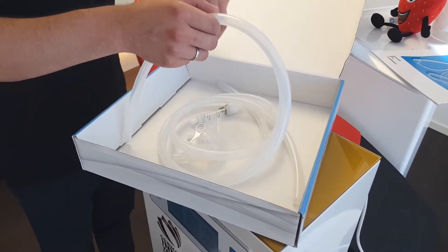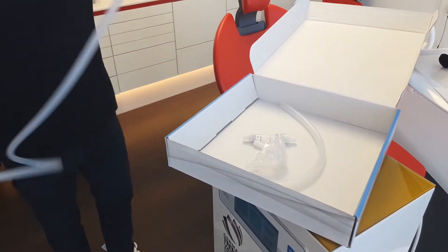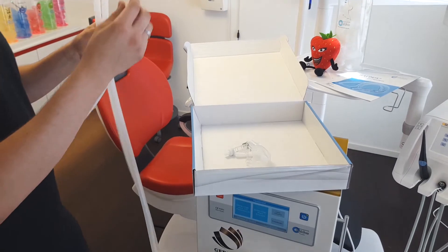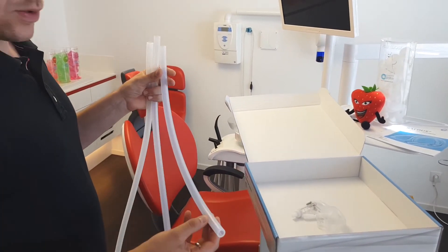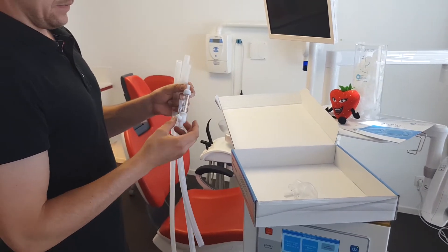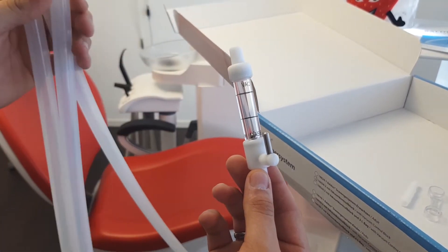Now you can assemble the vacuum tubing. We have a long vacuum tube and a short vacuum tube. The vacuum control block needs to be connected in the proper direction between the two lengths of vacuum tubing.